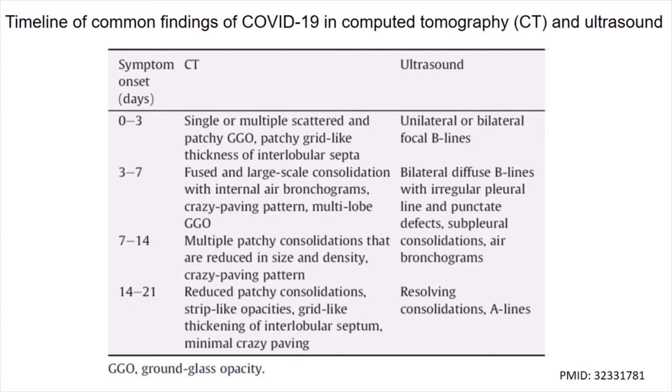Based on published studies, the main finding in the chest CT scan of patients diagnosed with COVID-19 is ground glass opacity, a finding that is difficult to detect via lung ultrasonography. In addition, ground glass opacity is mainly observed in the posterobasal regions that might not be easy to reach for the radiologist performing the examination due to the patient's position at the bedside.